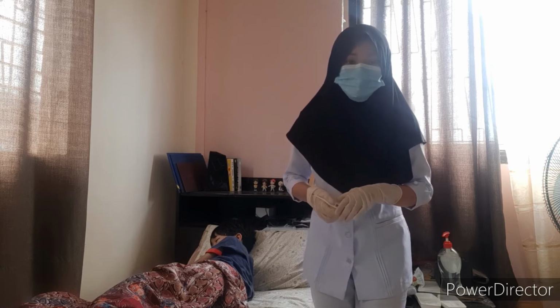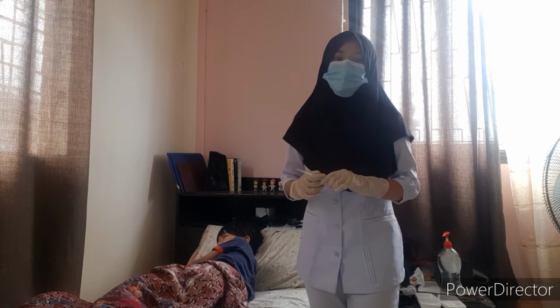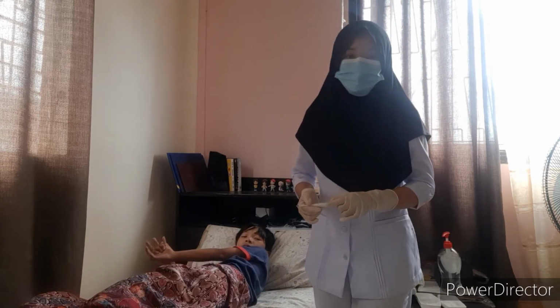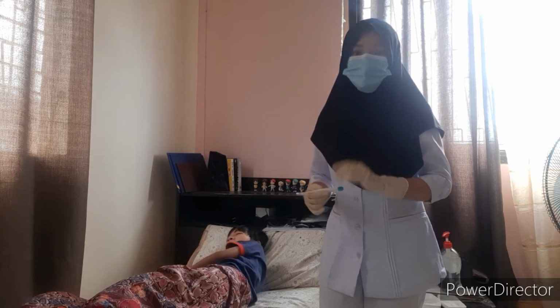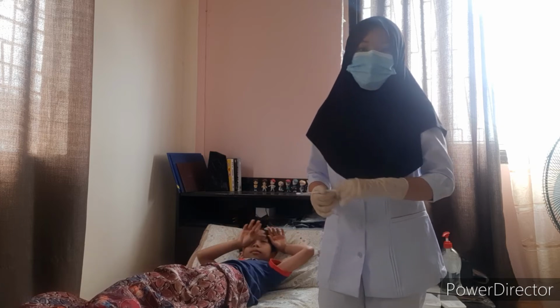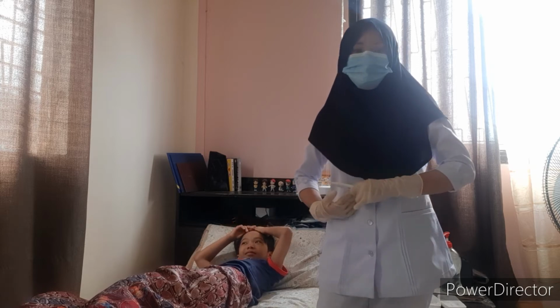So spread the buttocks and insert the tip of the thermometer no more than half an inch into the rectum, and never force. If resistance is encountered, hold the thermometer in place for 2 to 3 minutes. So this is to fully expose the anus for the thermometer insertion.